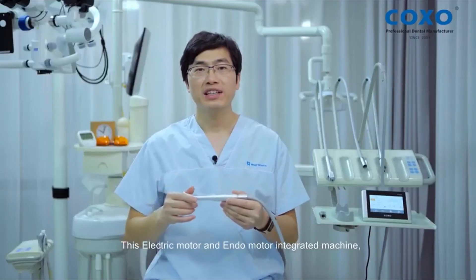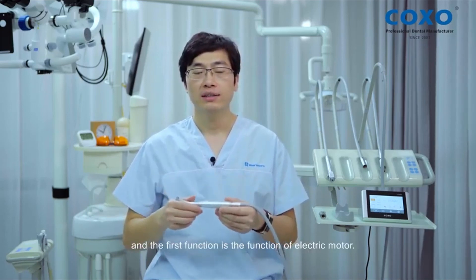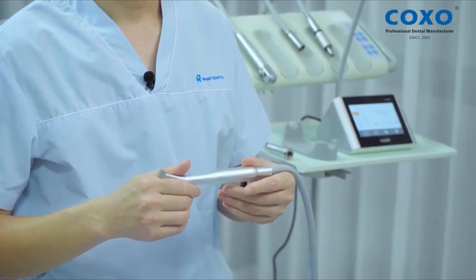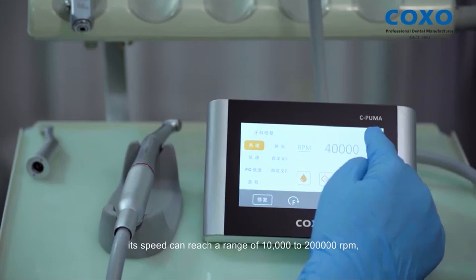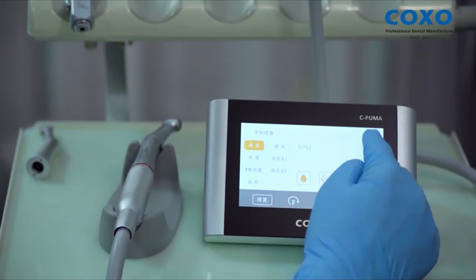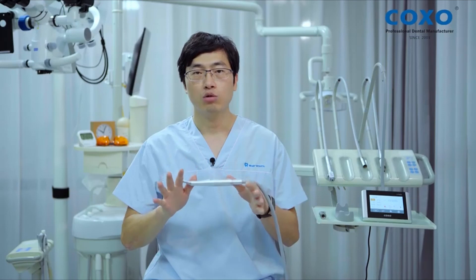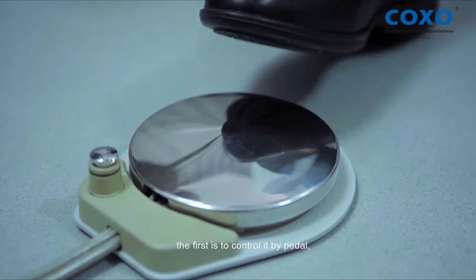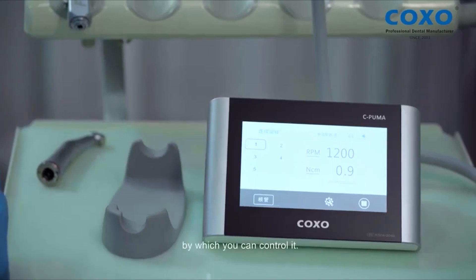This electric motor and endomotor integrated machine has two functions. The first function is the function of electric motor. In this mode, we can equip a one-to-five high-speed handpiece. Its speed can reach a range of 10,000 to 200,000 RPM, and we can easily adjust its speed on the LCD screen. There are two modes to control it: the first is to control it by pedal, and the second is by a key on the LCD screen.